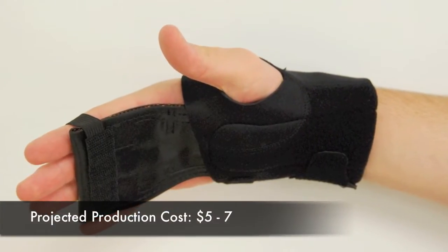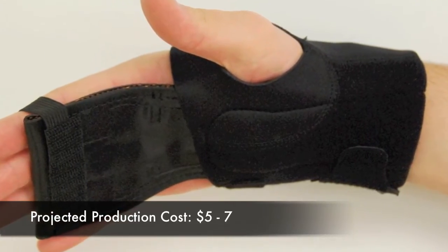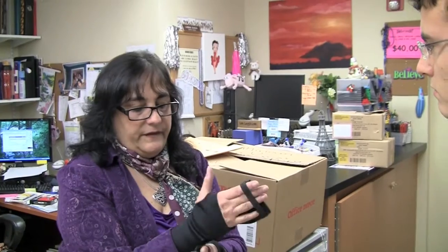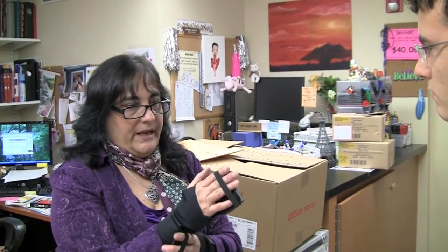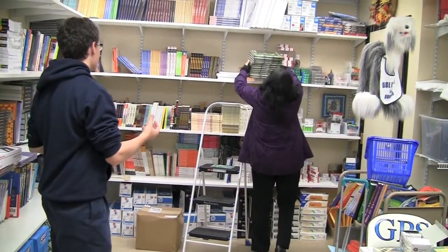We estimate that the final Hold will have a production cost of $5 to $7, with the neoprene and rubber grip accounting for the majority of the expenses. However, the final approval of the Hold came from Lori herself. It took away a lot of strain on my hand, and I didn't feel the normal pain I get in my wrist from lifting the books. I can tell you for sure, when I'm at my busiest with the boxes, the books, which is the summer, I will always have them on.